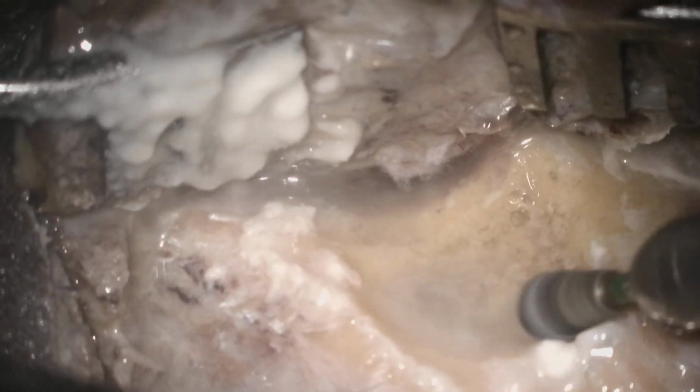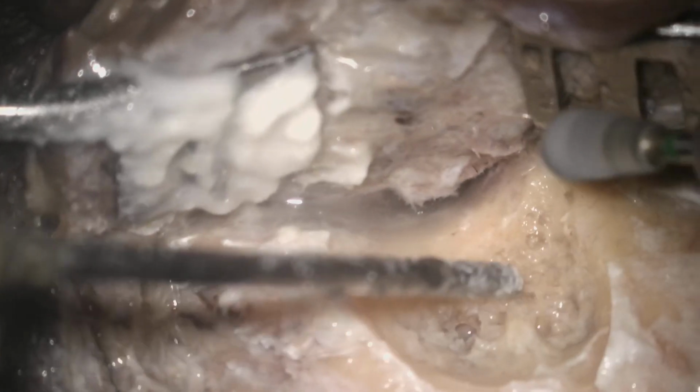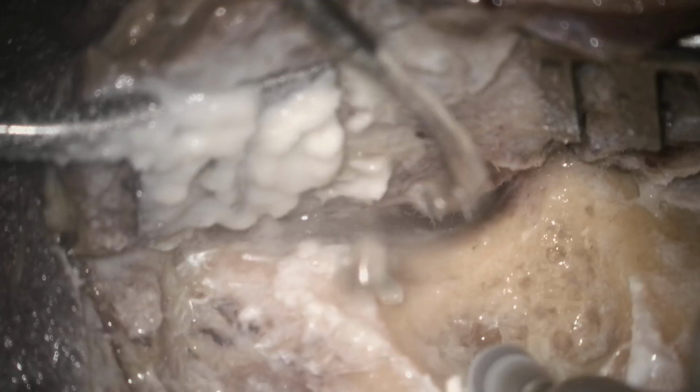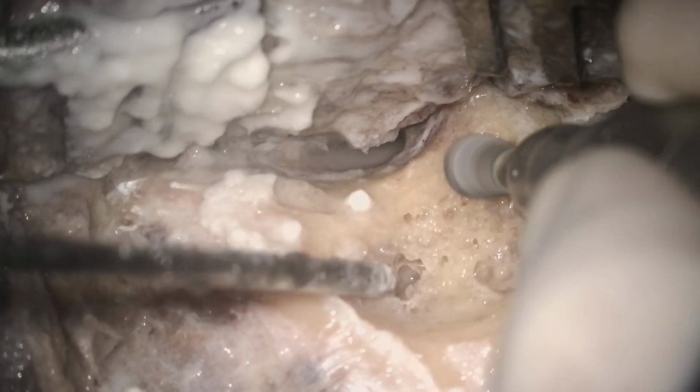So this will be your direction. Slowly and smoothly you will go to and fro according to the direction of the important structure. When we come to the posterior part toward the sigmoid sinus, we will drill like that, according to the direction of the sinus or the sinus plate. So the direction of the rotating bur should be parallel to the important structure.